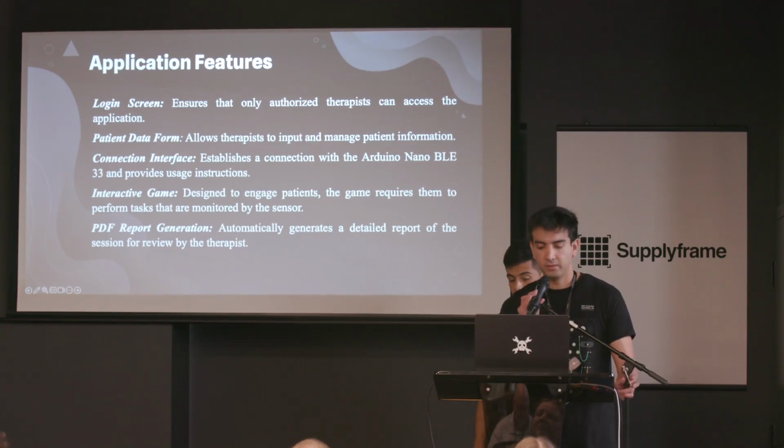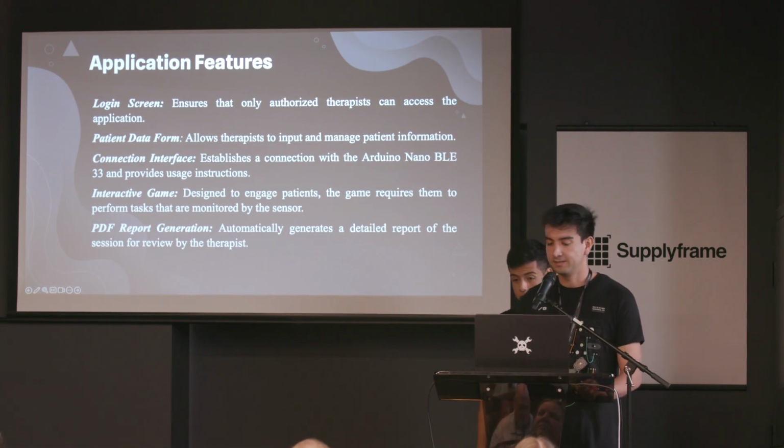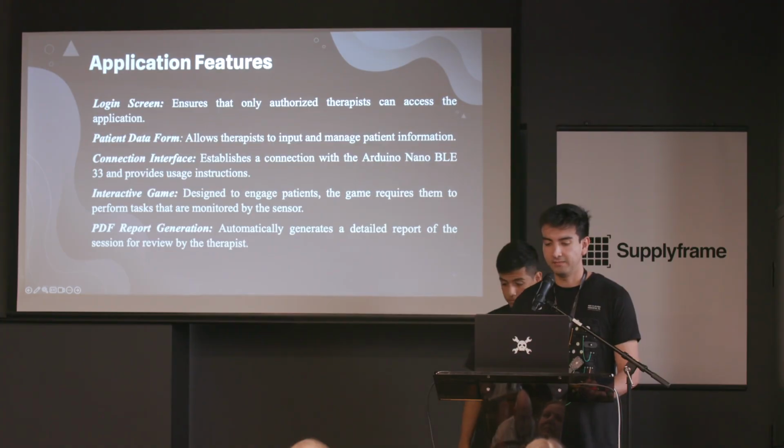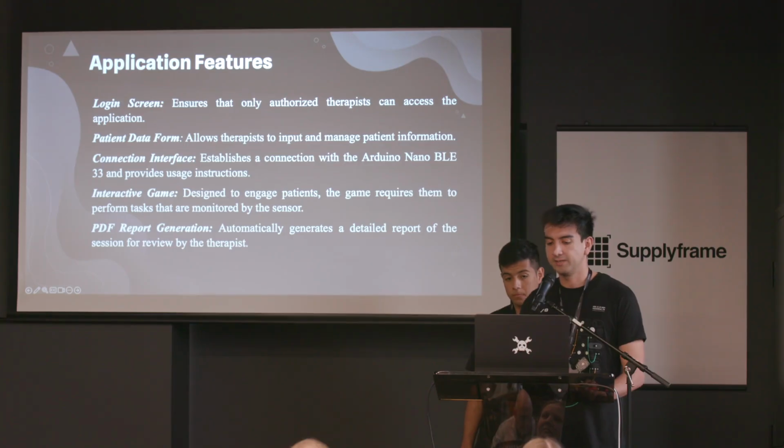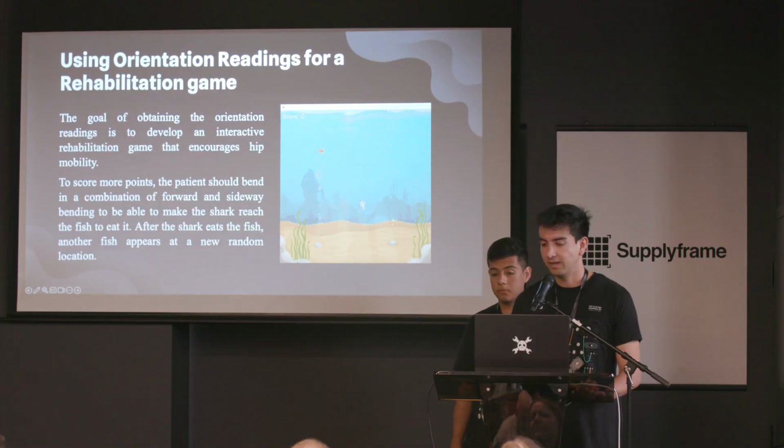What you will find in the program first is a login screen that ensures that only authorized therapists can access the application. Then there is a patient data form that allows the therapist to input and manage information on important variables like height, weight, and age. The connection interface provides usage instructions for connecting with the device, and the game itself requires the patient to perform tasks that are monitored, and finally generates a PDF with the medical report and all the results and data. So what is the game itself?